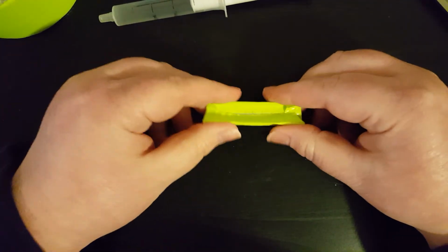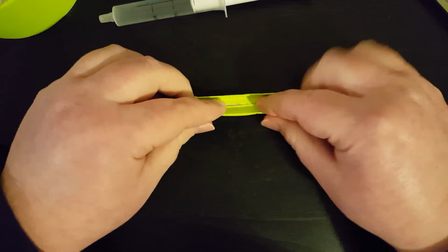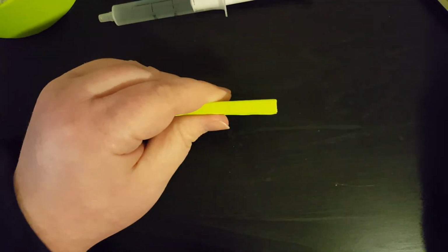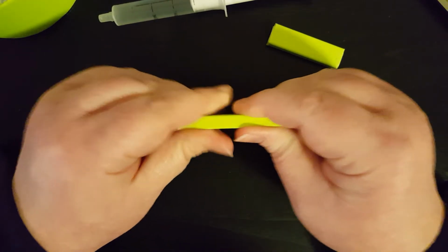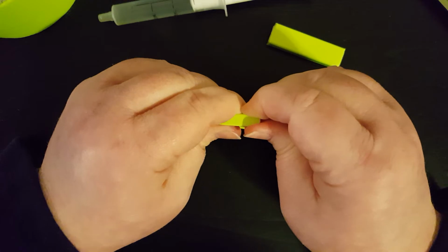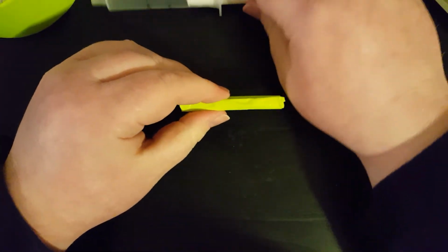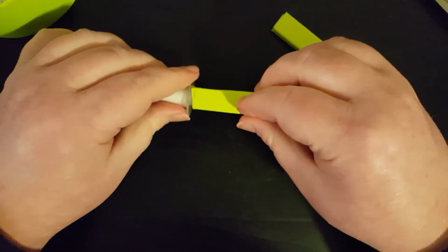There is a little bit of gap, so I would probably do this more than once with another layer of duct tape, okay? And I've already got one that I've done previously, so we can skip any additional. But what I want you to see is you can actually feel these breaking when I'm squeezing this, okay? They're breaking inside the duct tape, and that's okay because they're still not going anywhere. So now I have this for as long as I want it, until it's worn out.